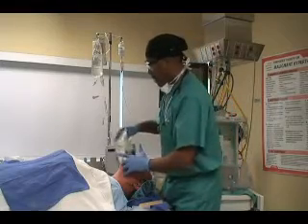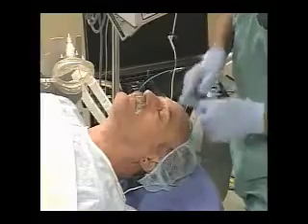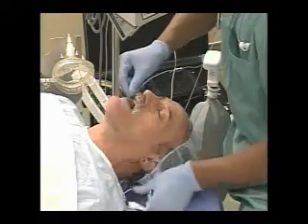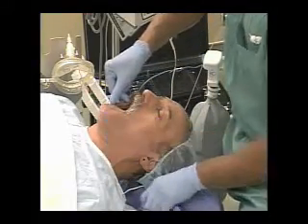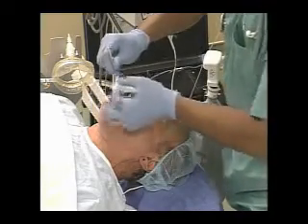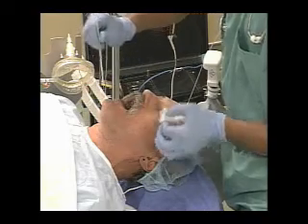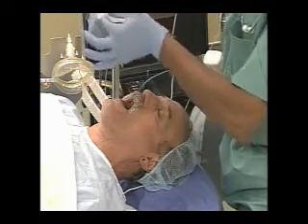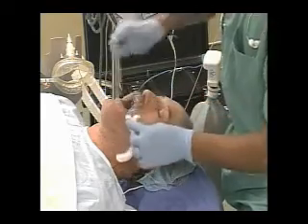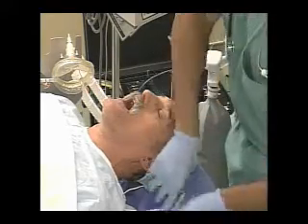Now, if there's an airway problem, I have my oral airway available. And with the oral airway, the thing I will do, I will open my patient's mouth with my fingers. I will use my tongue blade, slide it down, past the patient's tongue, push forward and lift a little bit, and just slide my airway down, and it will fit in place like so.